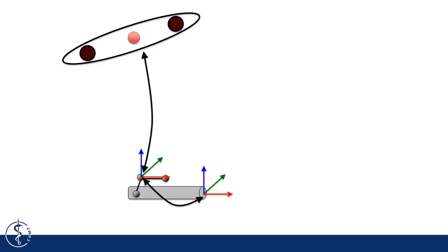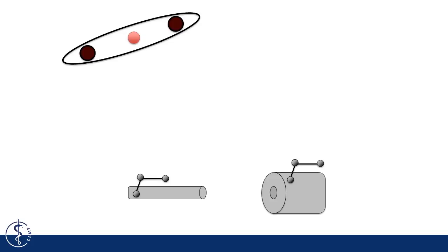To track the location of the gamma probe, a so-called tracking target made out of a set of marker spheres is attached to it. The only unknown now is the spatial relationship between the tracking target and the tip of the probe that detects the photons. By inserting and rotating the probe in a precise calibrator with known geometry, all geometric unknowns of the system can be determined.